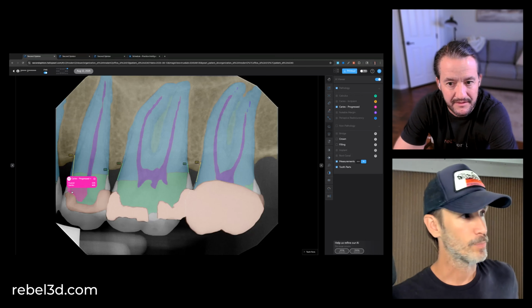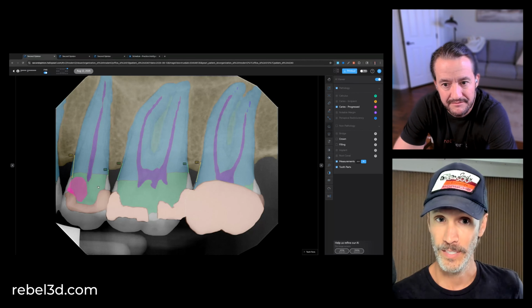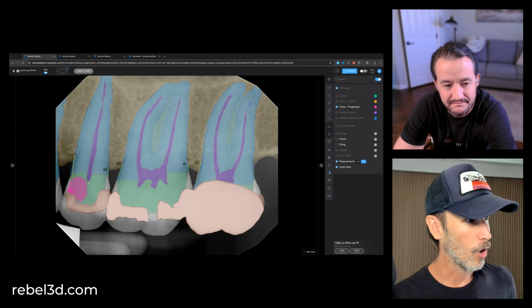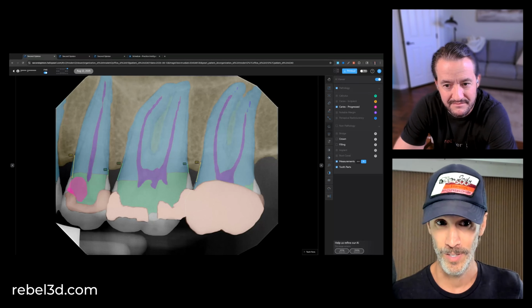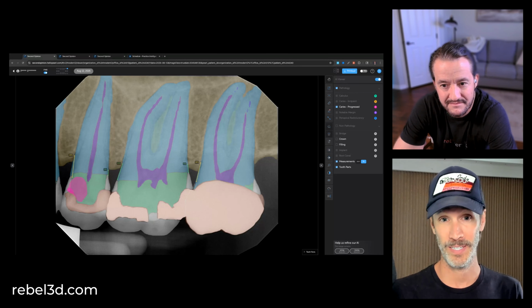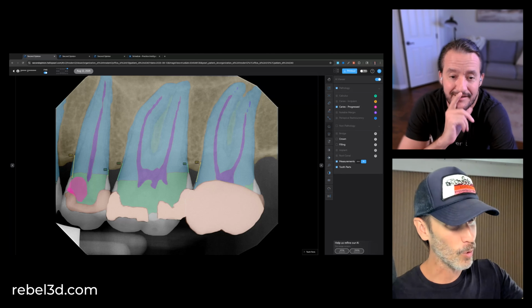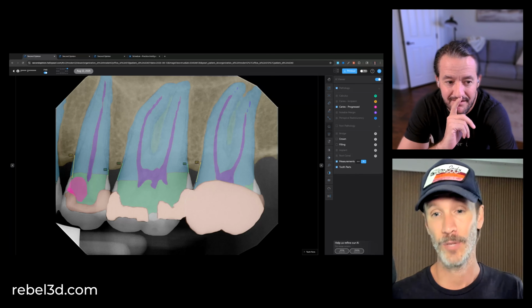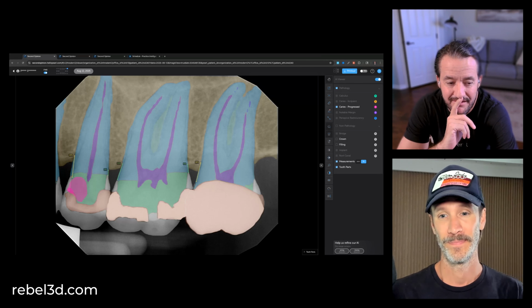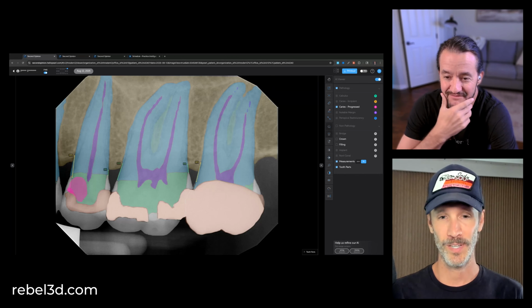You see, Mrs. Jones, this pink area? That is the cavity that we see in your mouth. And you see how it's almost touching this purple area? This purple area is actually your nerve. This is something that we may want to take care of quickly, because you see, we're only going from that pink through that tiny area of green and could potentially touch that purple. And if it touches the purple, is that then where we need endo? And that means we're talking about a root canal.